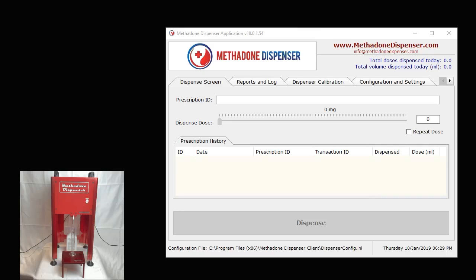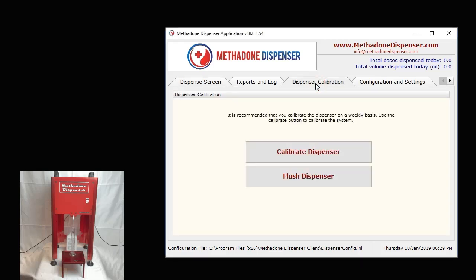In our case, the methadone dispenser has a built-in calibration routine that can be run as many times and as often as you wish. So let's go and see how we calibrate the dispenser. There's a dispenser calibration tab that you'll notice, and we click on that tab and there will be a calibrate dispenser button.